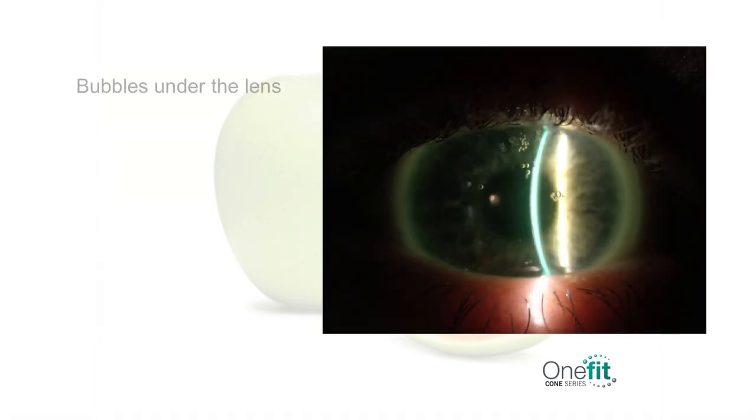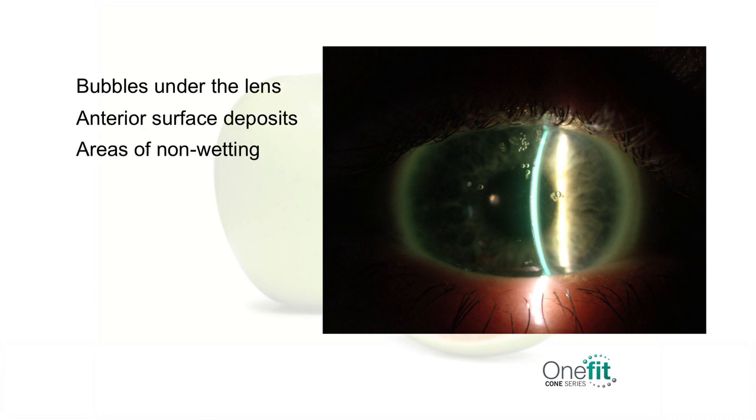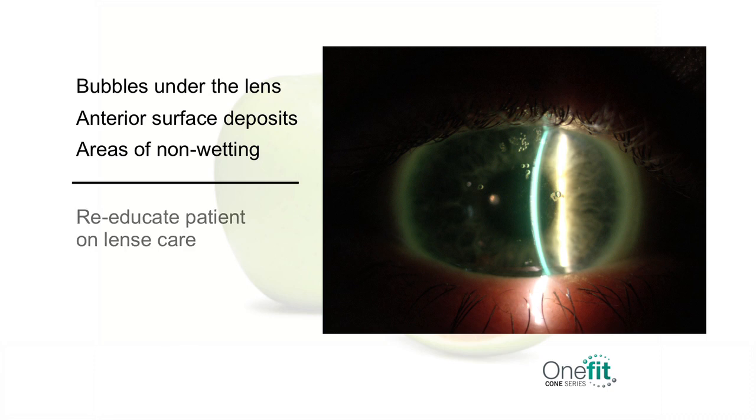If vision is insufficient, make sure that there are no bubbles under the lens and check for anterior surface deposits and areas of non-wetting. If any of these are found, re-educate the patient on lens care or consider recommending hydrogen peroxide solution. If none of these causes are present, then perform a spherocylindrical over-refraction to identify any residual astigmatism.